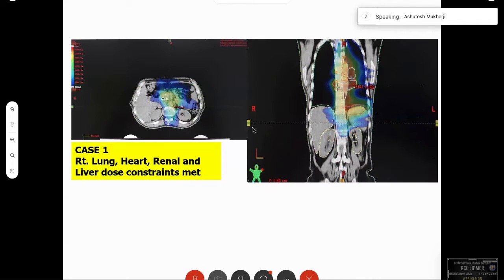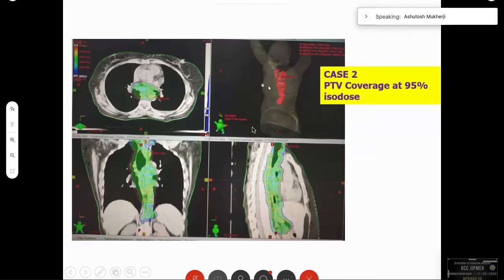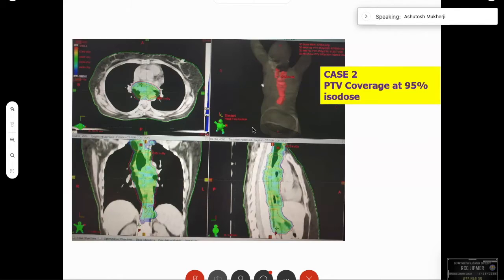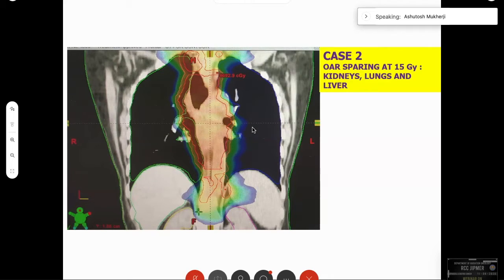In another esophageal case, the lung constraints were met, the liver constraints, and kidney constraints — all of them met. This is the benefit of modern technology — we are able to meet constraints even in such extended field treatments. Even at the 15 Gy isodose line, we are able to protect all organs at risk.